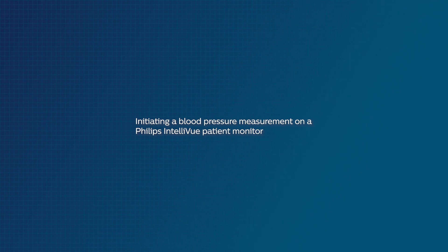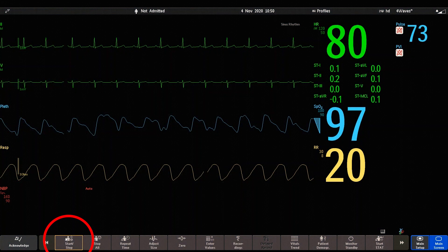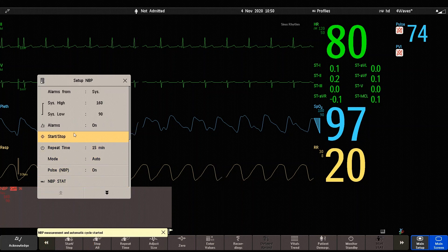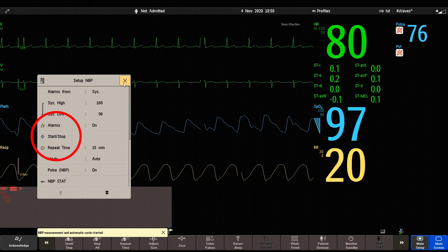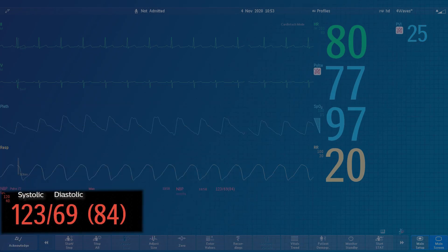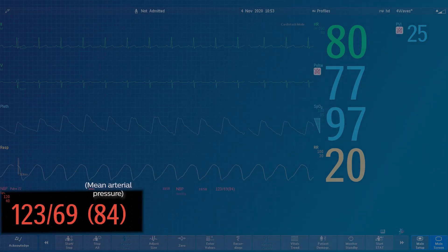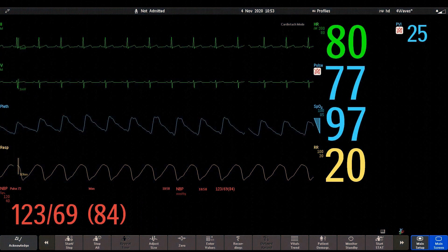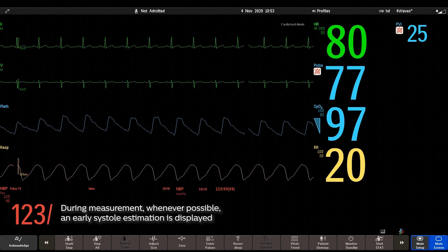To initiate a blood pressure measurement on a Philips Intelliview patient monitor, select the start-stop smart key at the bottom of the monitor interface, or select the corresponding start-stop operation in the NIBP setup menu. The NIBP measurement is displayed on the monitor as systolic over diastolic with the mean arterial pressure in parentheses. The pulse value derived from NIBP is also shown when selected. During measurement, whenever possible, an early systole estimation is displayed.